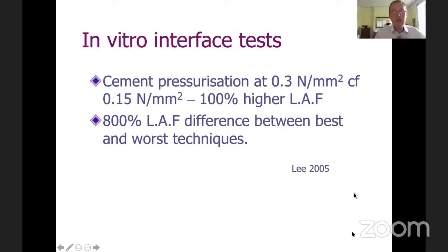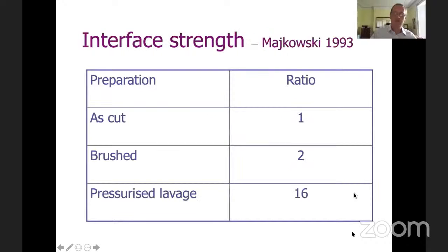If you pressurize it, again, much better. And if you do all of these things well, you can have an 800% higher load at failure compared to a technique that doesn't do any of those. And that's Clive Lee, one of the co-inventors of the Exeter stem's research.